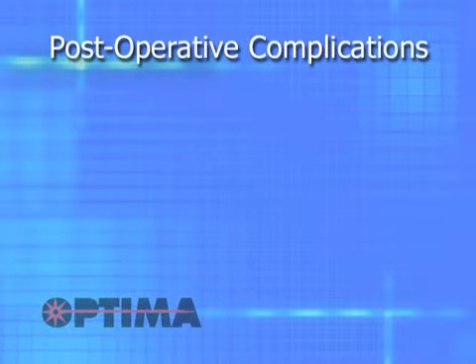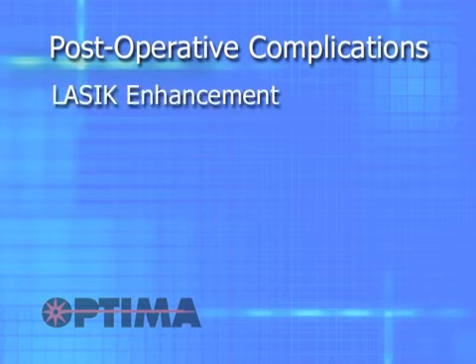Now, what about post-operative complications? Well, as I mentioned before, one of the most common post-operative complications is that the implant power that we select and measure for isn't perfect, isn't right on. And in those cases, a LASIK procedure would need to be done to fine-tune the vision to achieve our visual goals. But still, in certain cases, glasses may be necessary or contact lenses to achieve your best vision for certain tasks.